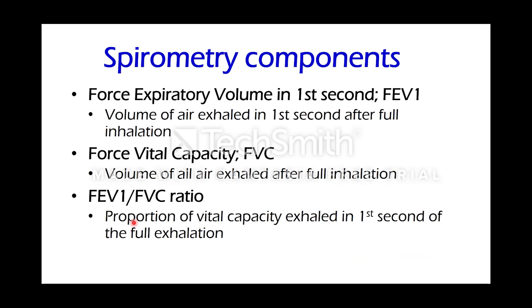reliable result. The components of the spirometry: the first one is the forced expiratory volume in the first second, or FEV1, which is basically the volume of air exhaled in the first second after full inhalation. And then the forced vital capacity, or FVC, which is the whole volume of air exhaled after full inhalation. And then the ratio between both of these parameters, the FEV1 to FVC, which is the proportion of the air exhaled in the first second to the air exhaled in the full exhalation.